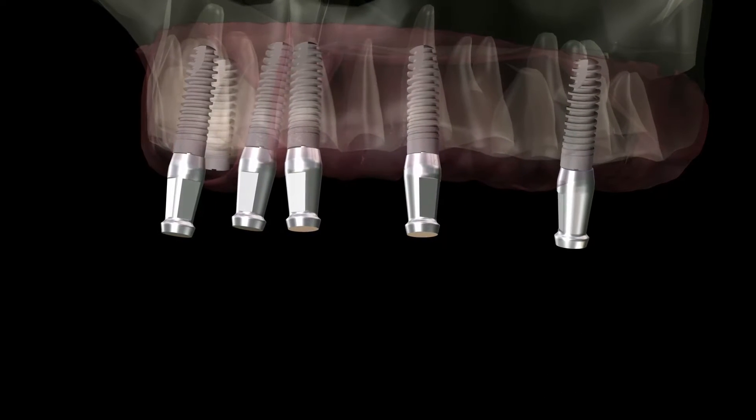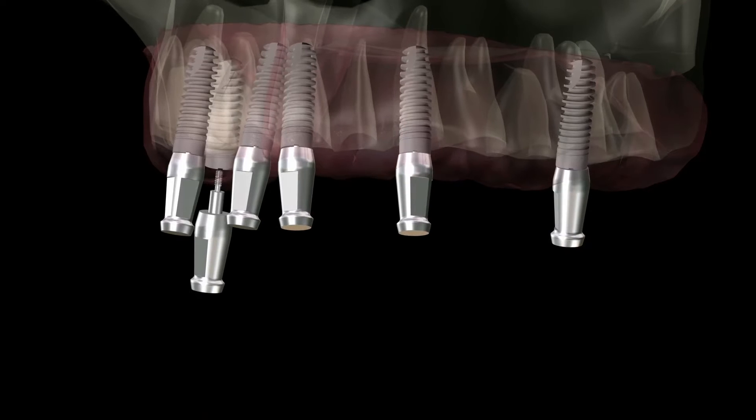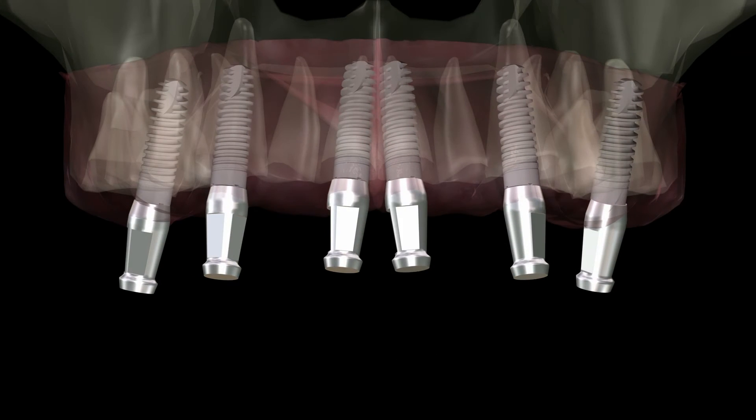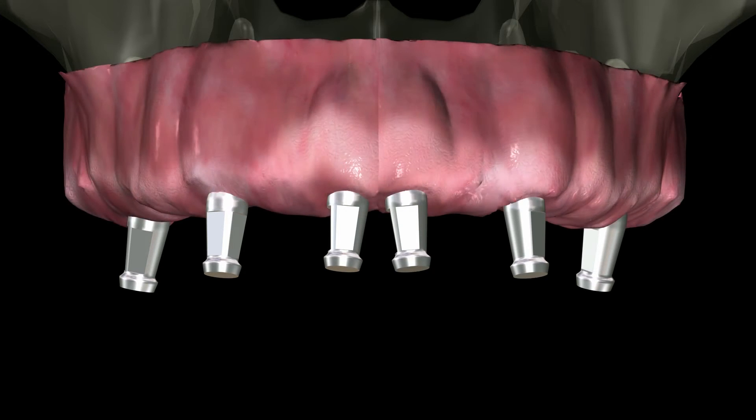Hand-tighten impression coping using the appropriate friction driver. Verify that each impression coping is completely seated. Radiographic verification can be used.